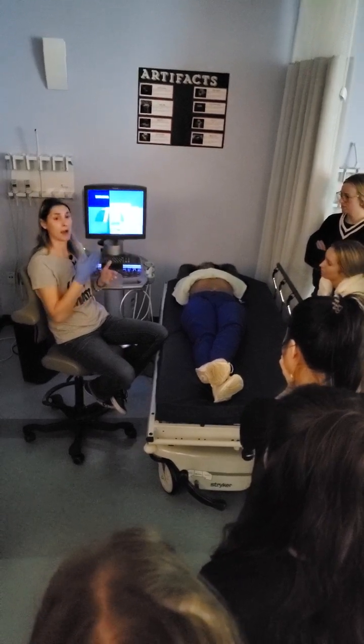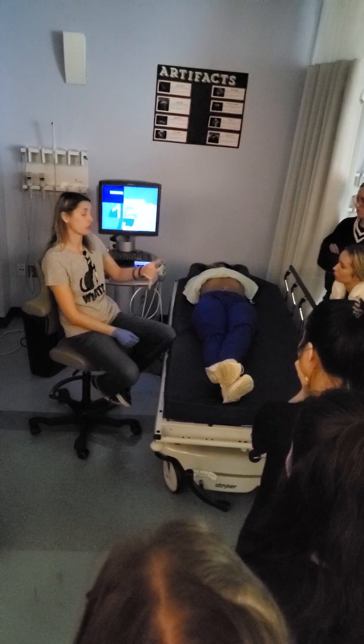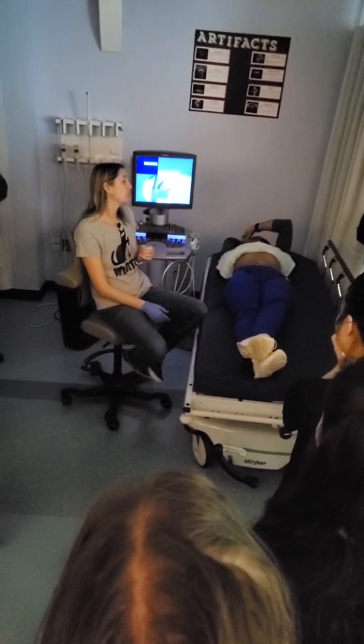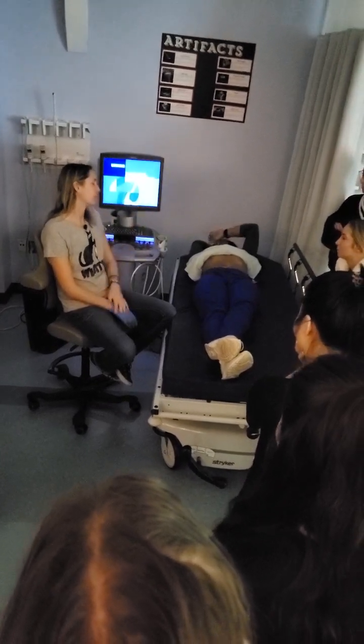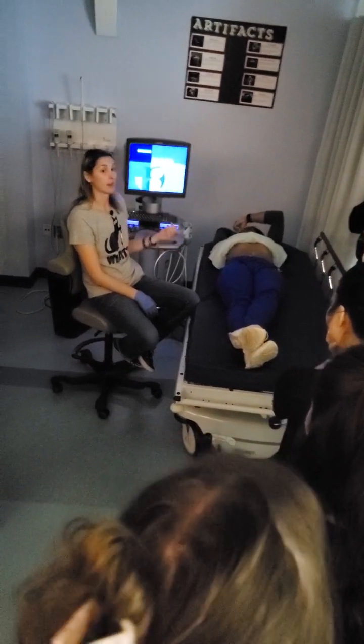Gallbladder, you're going to see go by, and we're going to evaluate it in two planes. Why do we do two positions? Why do we do that? To check mobility, and to see if anything is rolling around or rolling out of the neck. So we're going to do both a supine and an LLD.